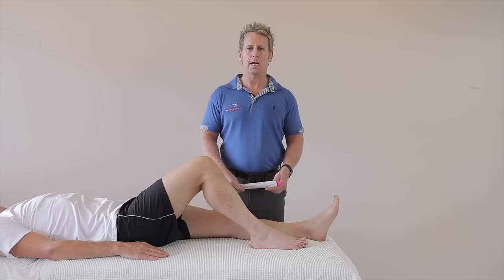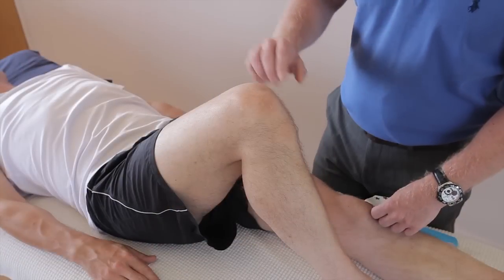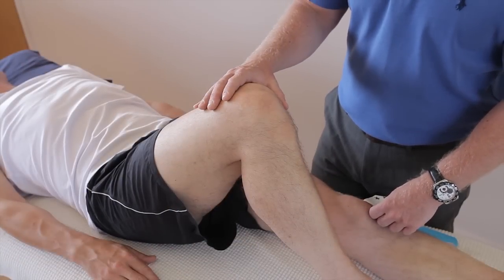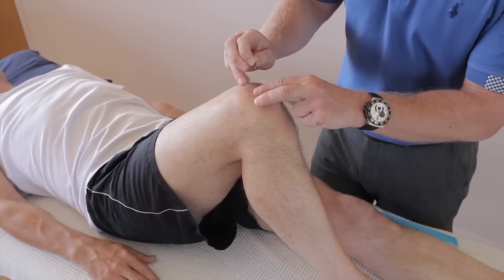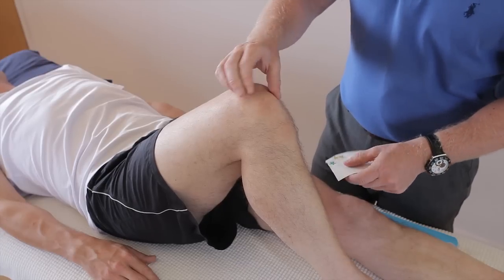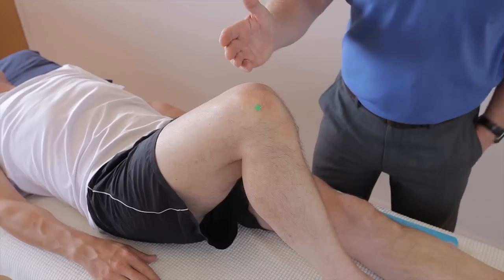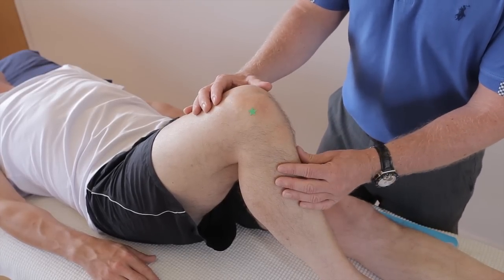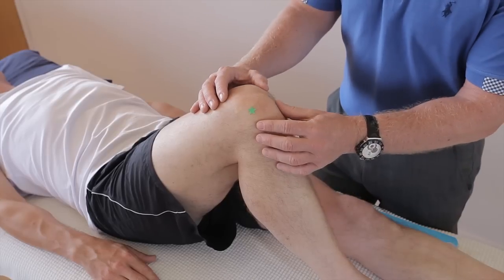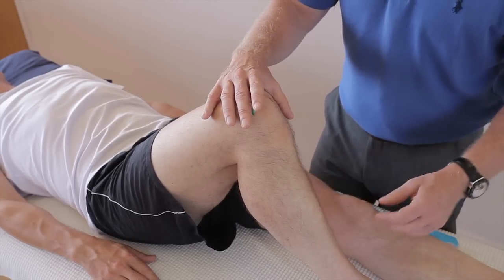In this video we're going to be looking at taping for the knee joint, and in particular patellofemoral syndrome pain. When patients present with knee pain around the anterior aspect — so this is the patella — they can have medial, superior, or lateral patellar pain. This condition might be patellofemoral syndrome, also known as anterior knee pain, and in the young known as chondromalacia patella. Kinesiology taping can actually help offload this area of pain.